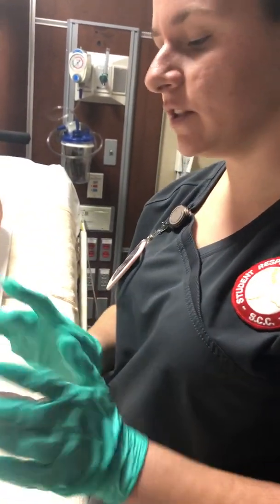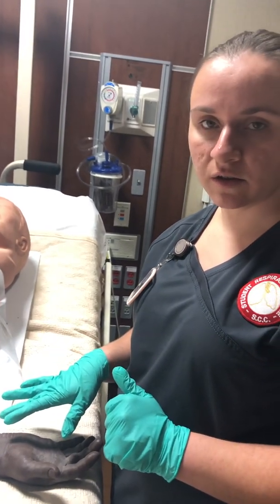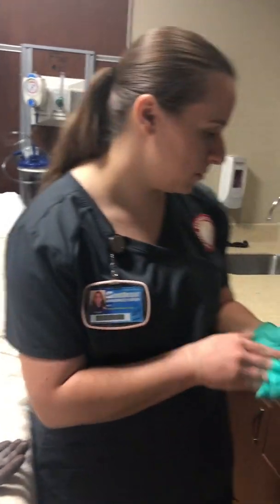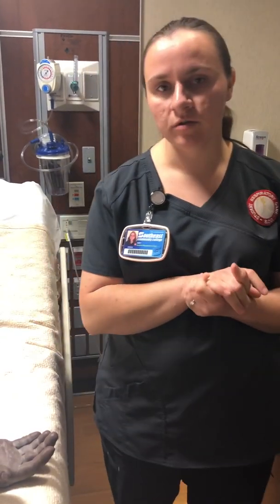Once I am all done, I make sure everything is cleared out and disposed of. I assess the patient again, check their vital signs, and make sure they're okay. Then I remove my PPE and dispose of it in the proper wastebasket, and wash my hands. I chart everything on their chart so that the other nurses and ARTs know that I got the blood draw done. And then I'd go to the lab.